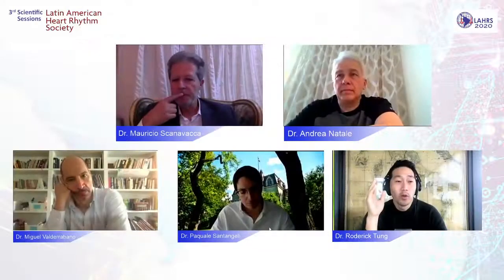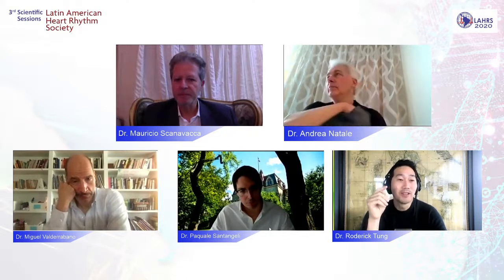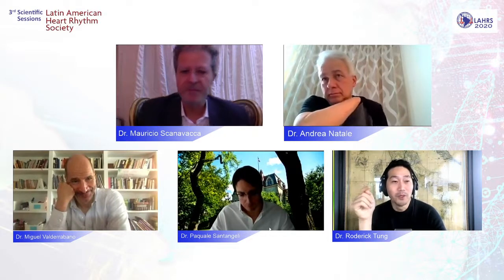I think that's a great point, Mauricio, because we don't ablate from the epicardium because it's closer to the esophagus. We use the epicardial mapping to guide the endocardial ablation, kind of like Miguel published at UCLA, epicardial mapping of WPW, but it was used to guide endocardial. And you could say, well, why is that useful? But it actually can be useful, because sometimes you burn in an area you wouldn't burn on the septopulmonary bundle because there's no electrogram on the near field.